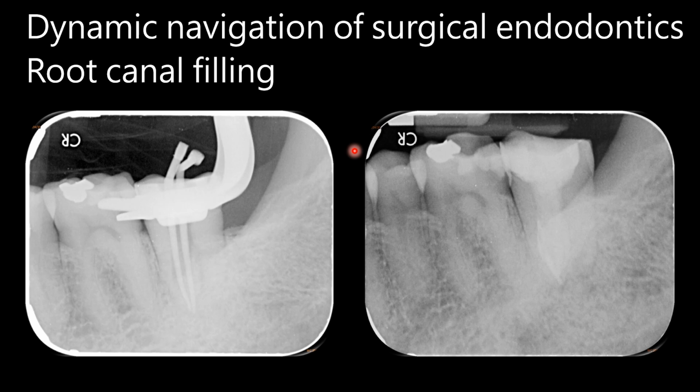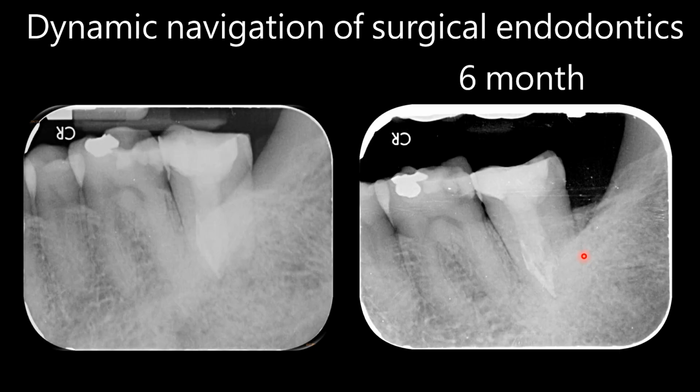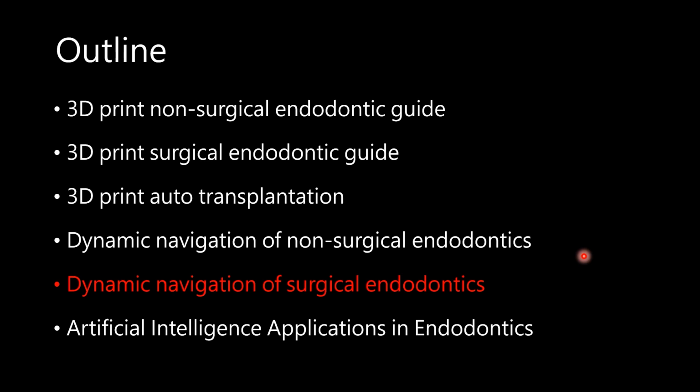So after I got into the root canal, I performed the root canal filling. And the patient is good, and he has no more complaint about the tooth. And this one is a 6 months follow-up. After the previous non-surgical endodontics, we get to the dynamic navigation of apical surgery.